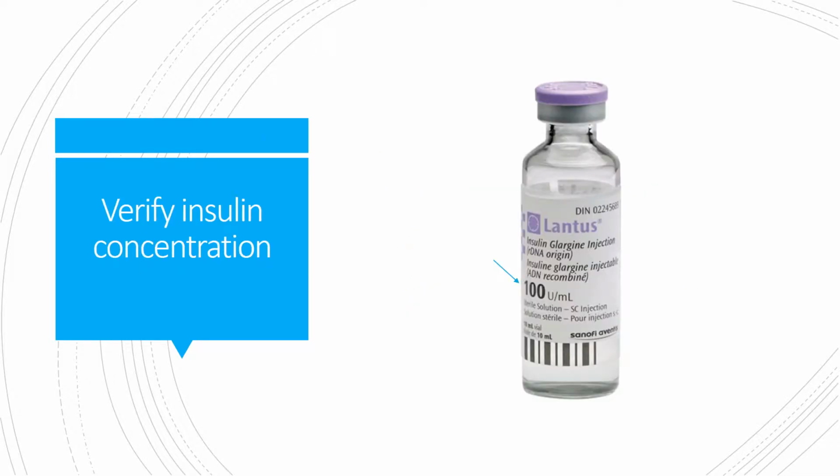So here is an insulin vial that we can look at to know the concentration. This particular vial is 100 units per milliliter. So that's very important for us to know so that we give our patient the correct dosage of insulin.